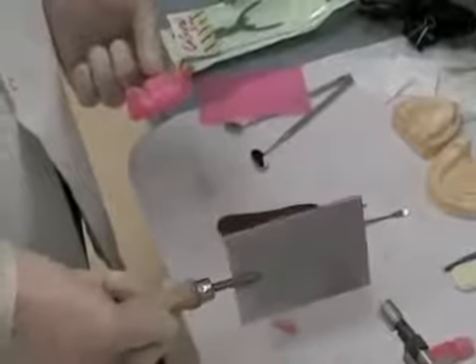Use a heated number 7 wax spatula to seal any wax that's been added to the wax rim to make sure that it's joined well and won't come apart when you're making some of the adjustments to your wax rim. Once you've sealed that to the wax rim, you can heat up the wax former using either a Bunsen burner or a butane torch.